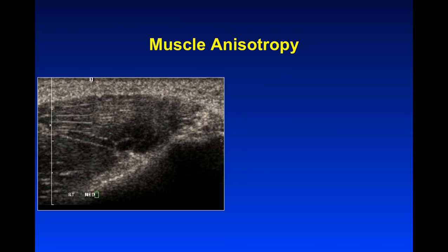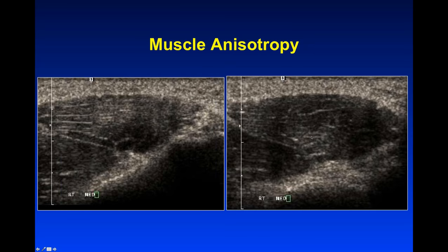Muscles can have anisotropy as well, though not as much as tendons. This is somebody with a painful latissimus dorsi muscle — I thought it could be a muscle tear, but when I rocked the probe it became bright while the rest of the muscle became dark. So it's not pathologic, it's actually normal. Always check for anisotropy before calling pathology — tilt the probe into whatever angles necessary to show that a hypoechoic area is not simply anisotropy.